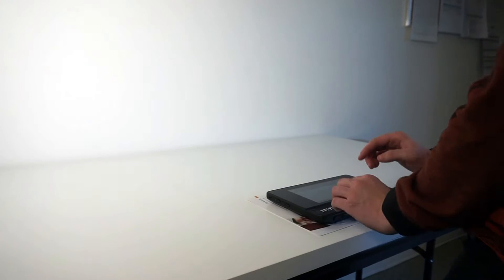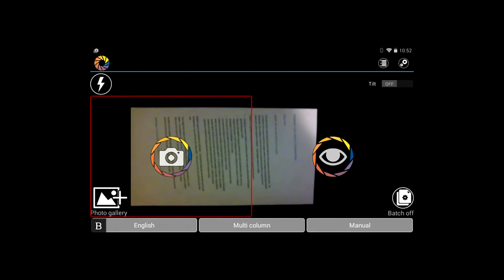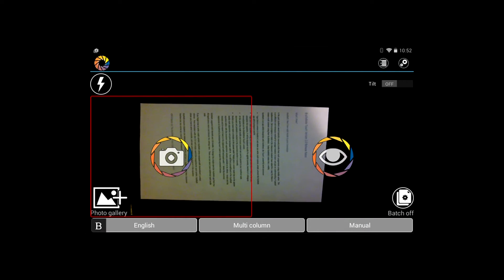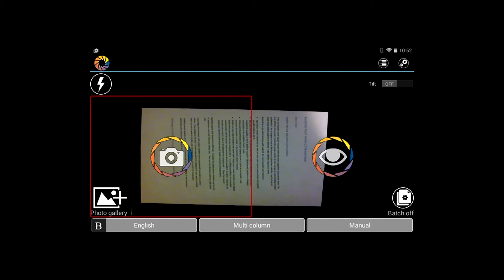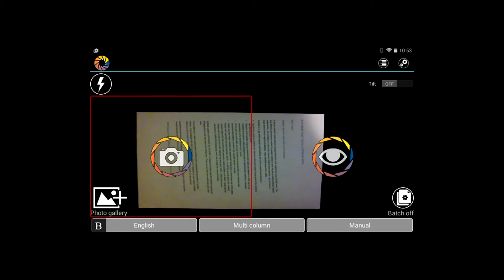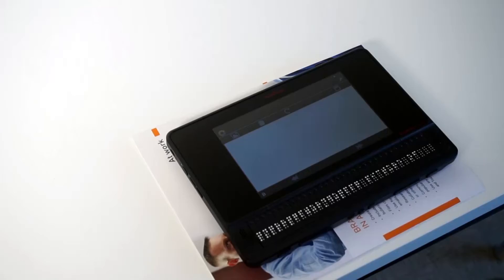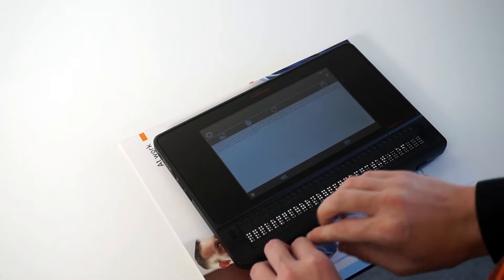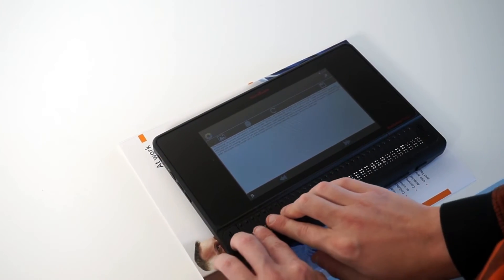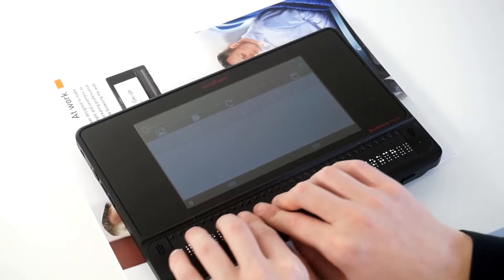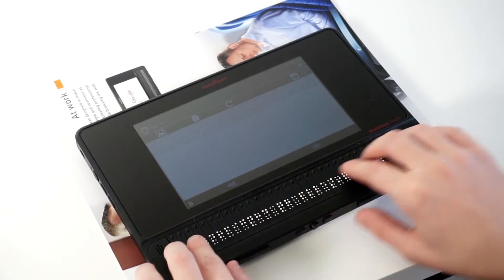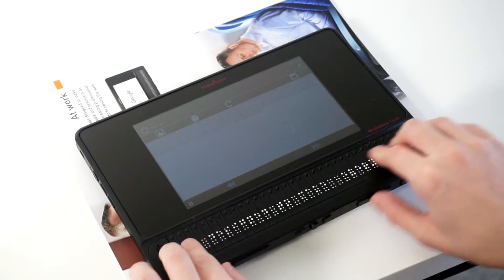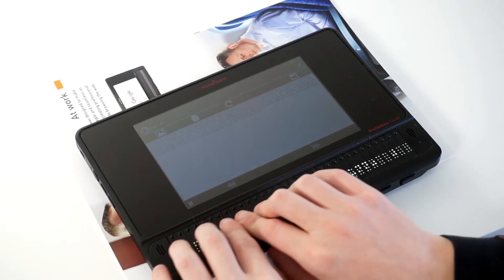You can get an understanding of how many edges of that print piece of paper are visible by activating the field of view report button. Within a few seconds, the optical character recognition will complete and you will have Braille on your Braille display.